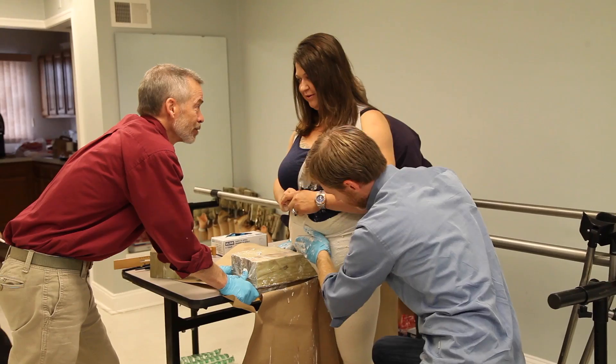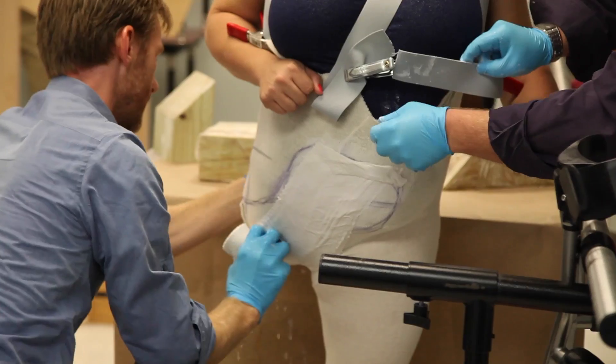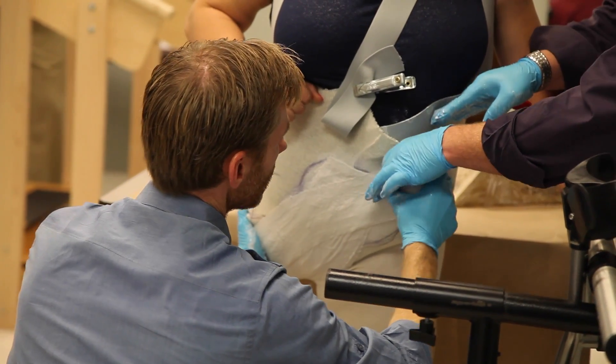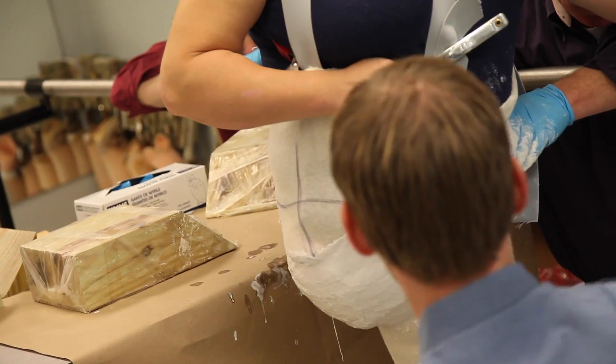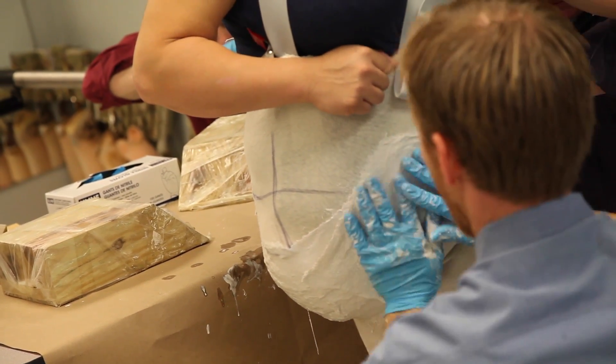Casting is a pretty basic thing. When you're a kid and you grow every six months, they would cast you. So in 25 years I have been through so many castings. Today was different — there was just so much less. Usually they're casting from here down, and today it was just so little. So I'm really excited to see the difference in the weight.